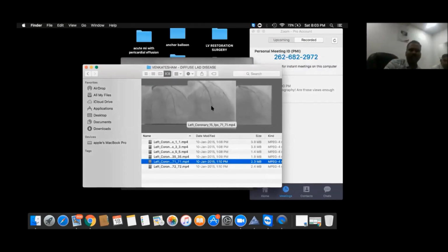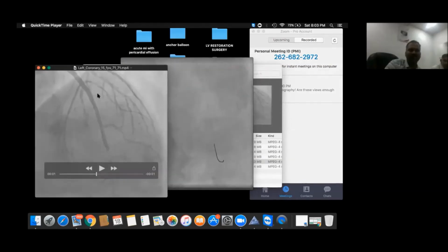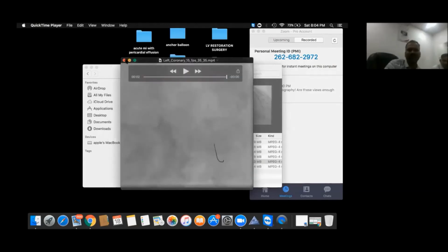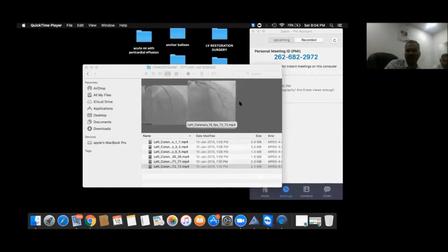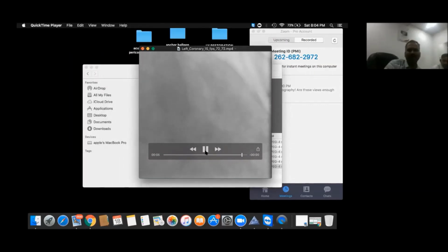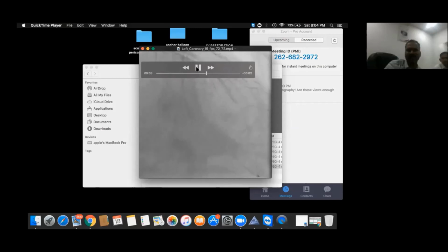So never take a revascularization decision without visualizing the vessel. You just see the vessel after stenting. So there is diffuse disease. We just stented this vessel, and this patient has been in follow-up for almost 4 years. He is doing fine. In fact, I advised a repeat angiogram just to understand how the distal vessel is behaving. You can see the distal vessel now.